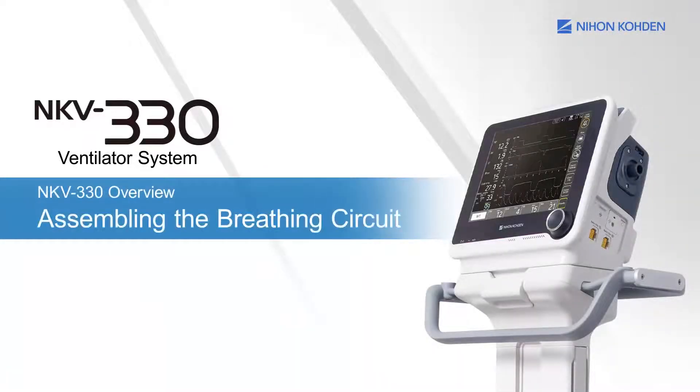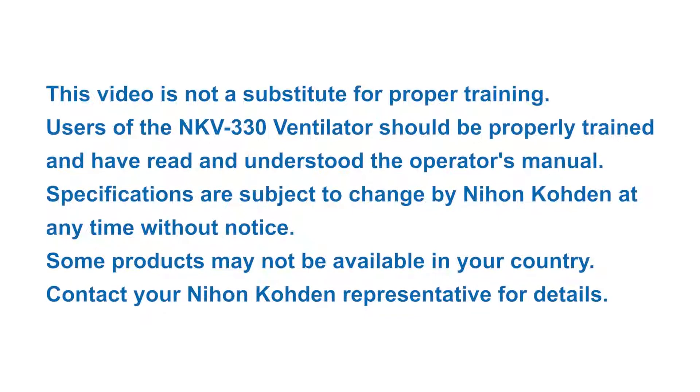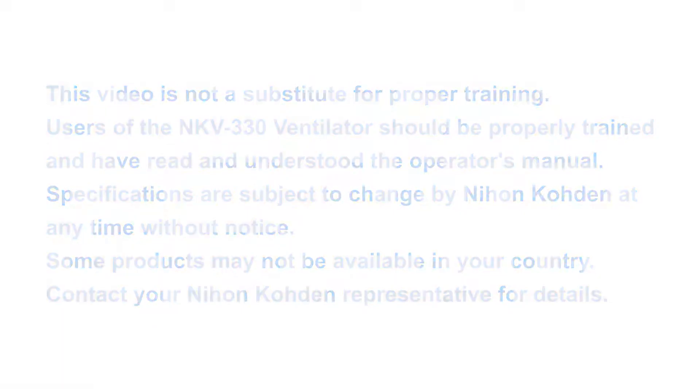This chapter explains how to assemble the breathing circuit. This video is not a substitute for proper training. Users of the NKV-330 ventilator should be properly trained and have read and understood the operator's manual. Specifications are subject to change by Nihon Kōden at any time without notice. Some products may not be available in your country. Contact your Nihon Kōden representative for details.